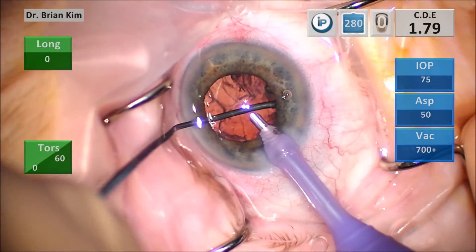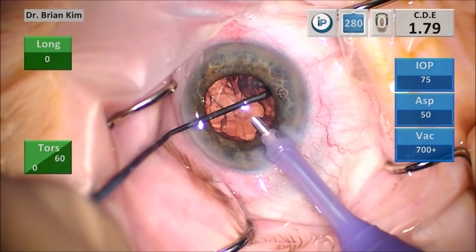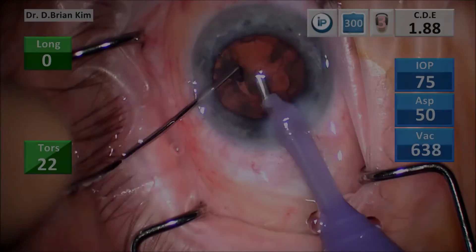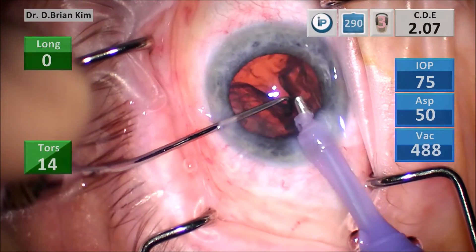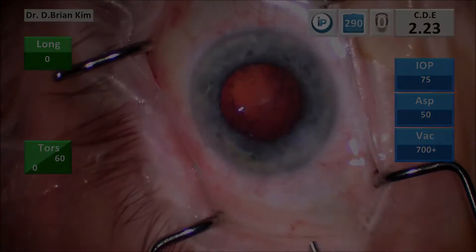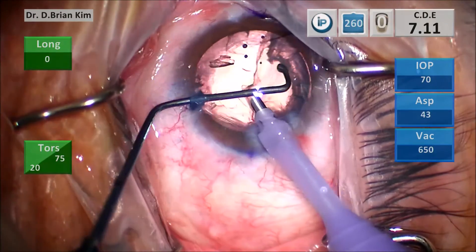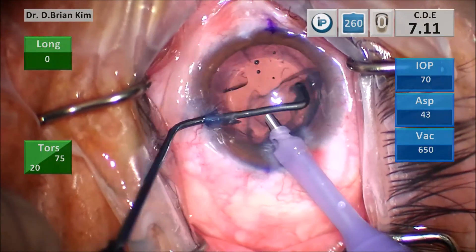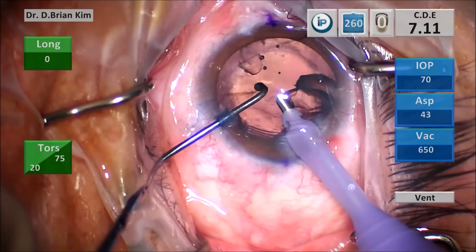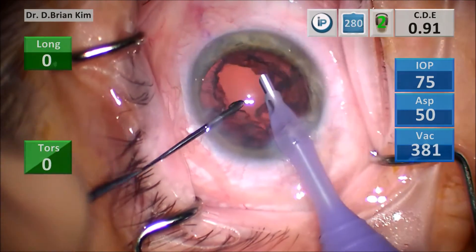Creating that space causes fluid to help mobilize the epinucleus easily. With a thinner piece of epinucleus, the principles are the same — go underneath, rotate my hand, and find that edge to lift the epinucleus. I use the chopper to lift the edge so it comes out, always rotating my hand to make sure the chopper tip is parallel to the epinucleus and the anterior capsule.